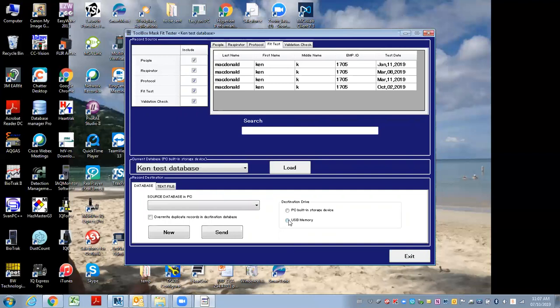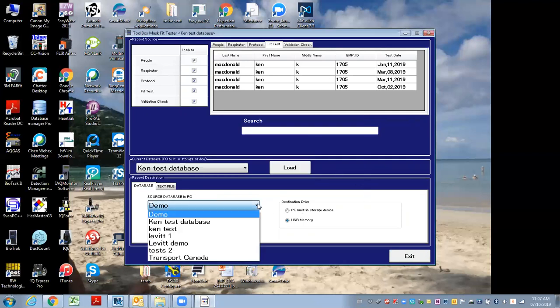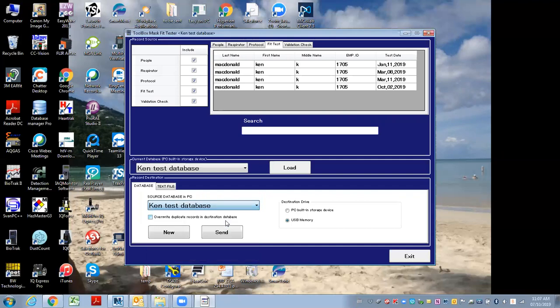I would first choose to create a USB memory stick. When I click that, it shows me what USBs are attached. So I choose this one — I've got that plugged in. I select it, exit back out, and I choose which database I want to export to that flash drive.